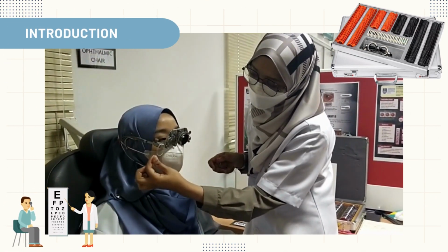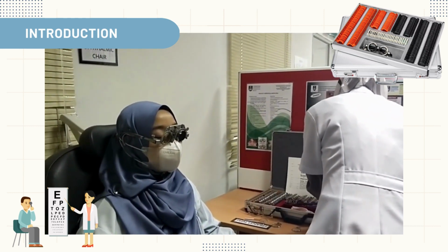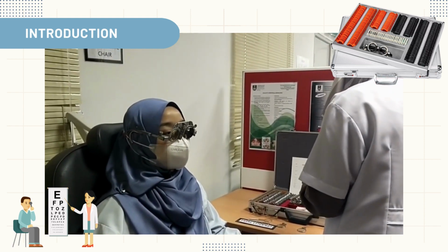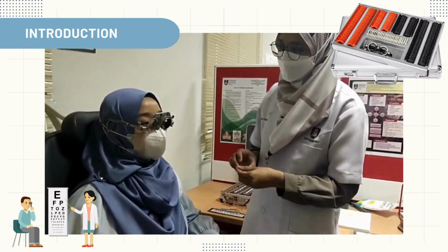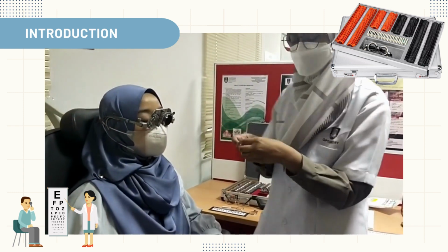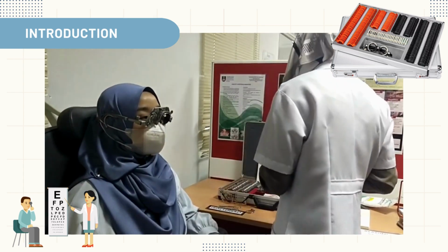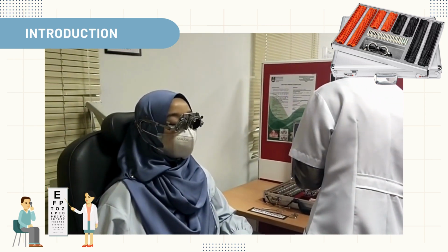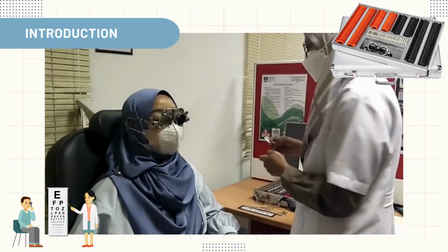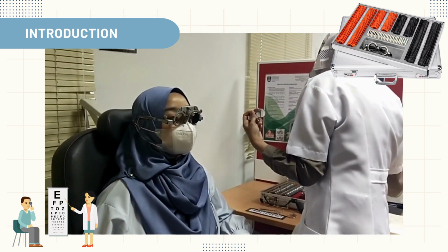Therefore, obtaining a good and accurate refraction in a low vision patient is extremely important because this is the starting point for prescribing any low vision devices. Clinicians must remember that the standard refraction techniques are employed when performing a trial frame refraction on an individual with normal sight, and JND refraction techniques are used for those who are visually impaired. When practitioners use JND refraction techniques, they are able to do accurate refraction at any acuity level.